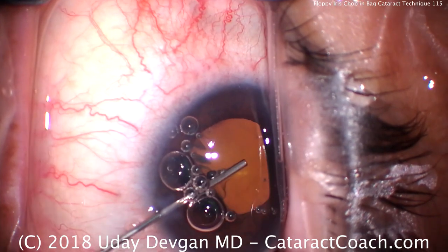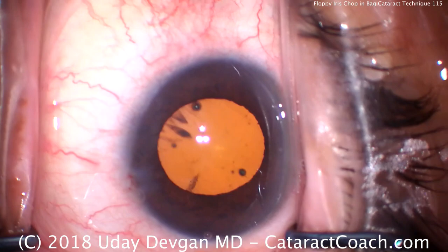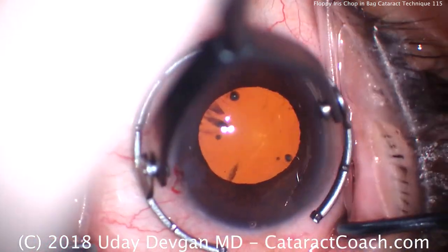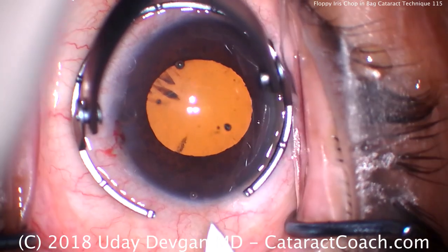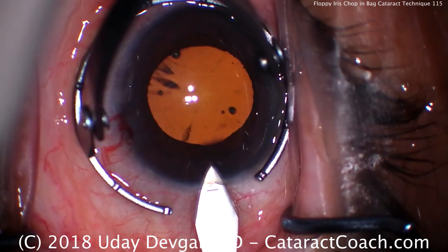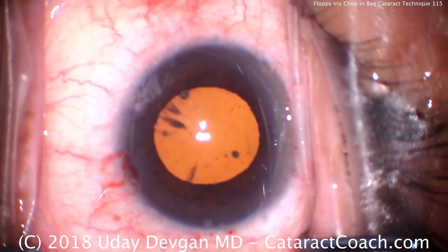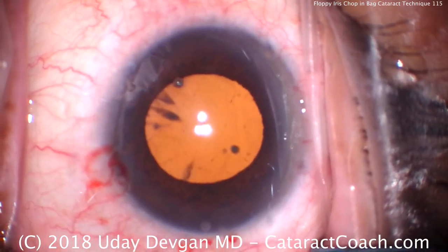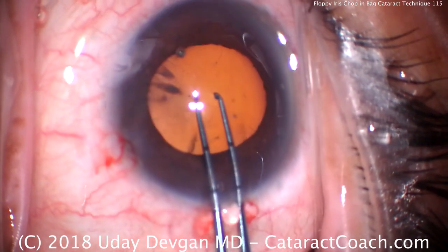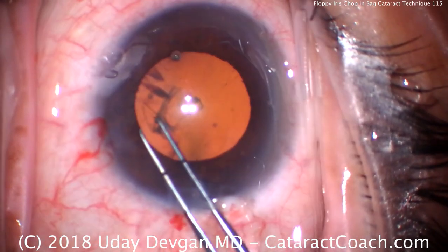In prior videos for these smaller mid-sized pupils with Flomax, I've advocated doing a large rexis and then pulling the nucleus out of the capsular bag and having the iris or the pupil hold the nucleus in position, operating there at the iris plane. But we had a few comments from users of our site who said, can you show me how to take care of this in the bag? Can I chop or disassemble the nucleus in the bag even if we have a Flomax case, a small pupil, a floppy iris, etc.? So let's show you how we do that.